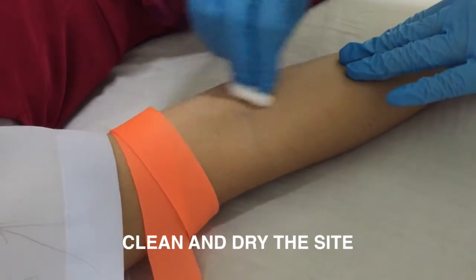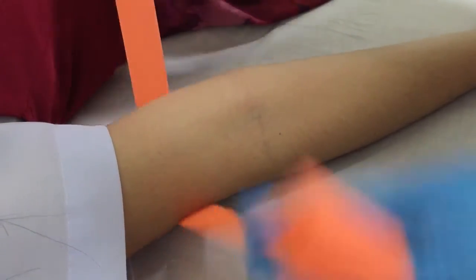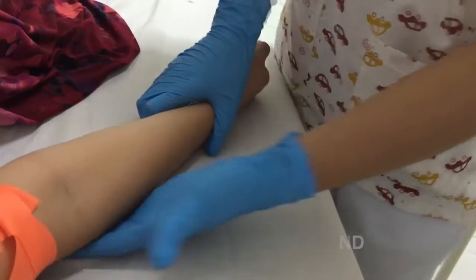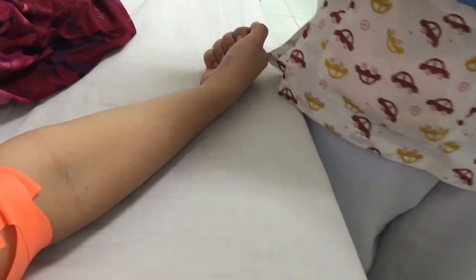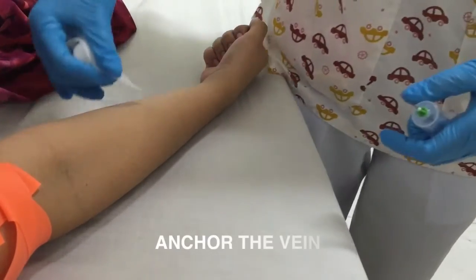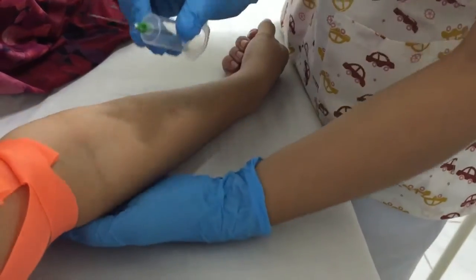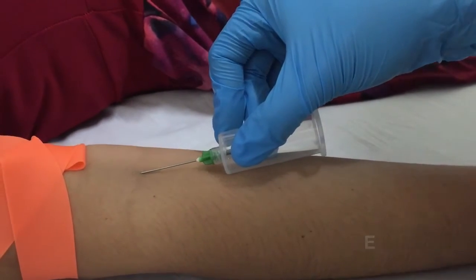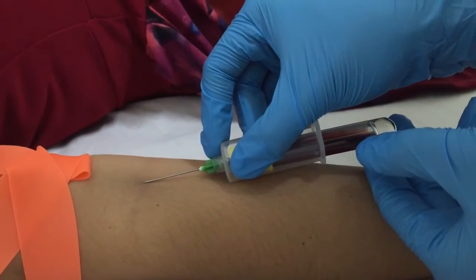Clean and dry the site — clean with an alcohol pad and let it dry for 30 to 60 seconds. Have the patient close their hands and ask the patient to make a fist — never have the patient pump their fist more than 1 or 2 times. Anchor the vein using only the thumb or index finger. Perform the venipuncture by inserting the needle in bevel-up position at 30 degrees or less.